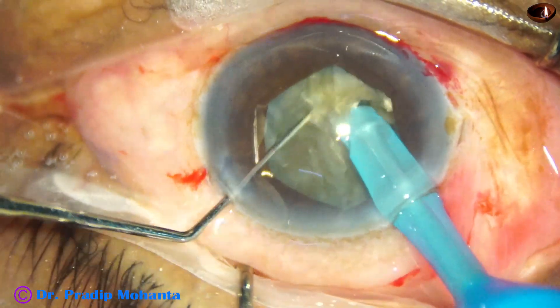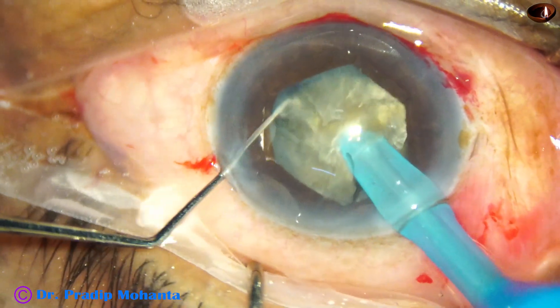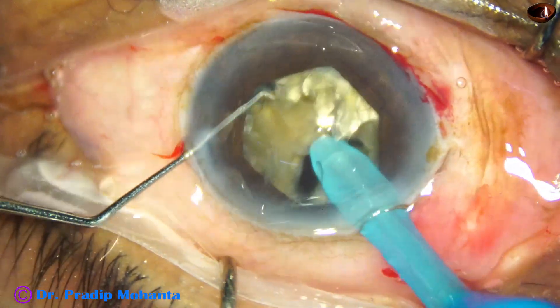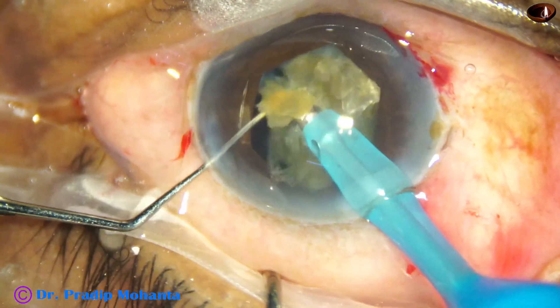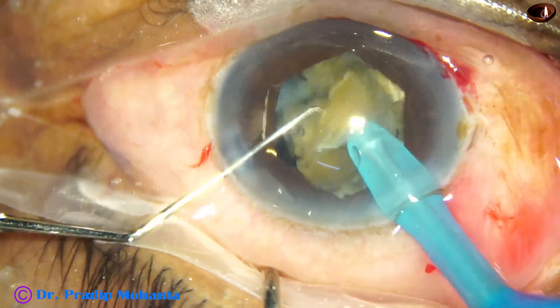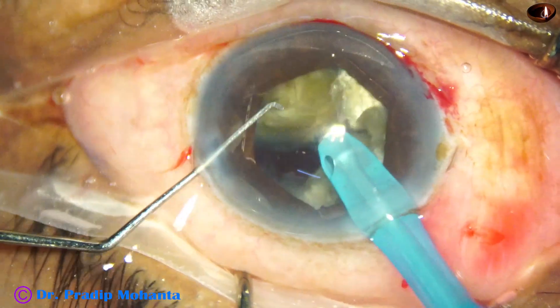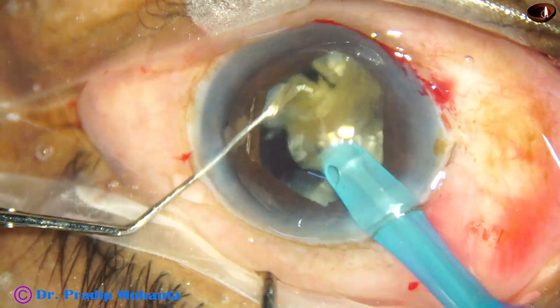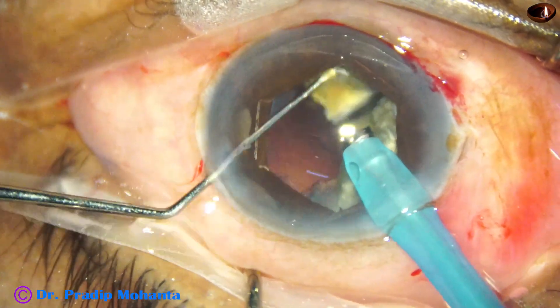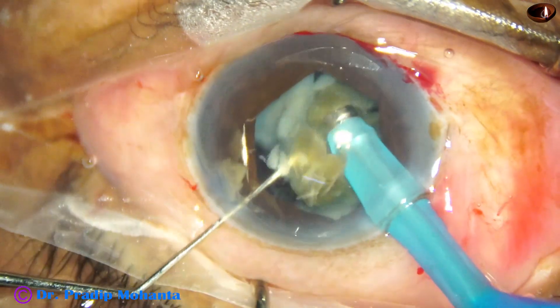Now this hemi-nucleus is being divided into three pieces. This is vertical chop — hold the nucleus very firmly, bury the chopper just in front of the phaco needle and get a good crack. Ultrasonic energy is set at 85%, flow rate is 48 ml per minute, and vacuum is 480 mmHg from the very beginning. This is the third nuclear fragment of one hemi-nucleus.